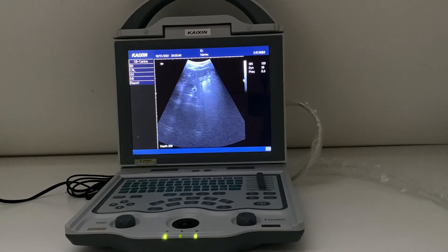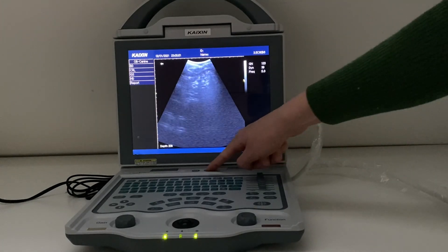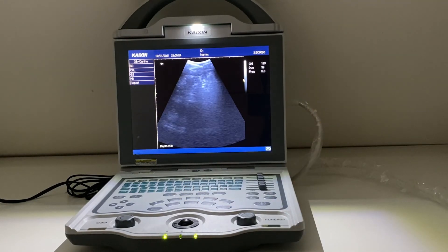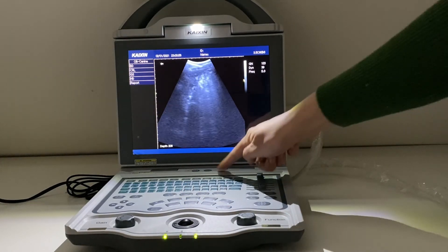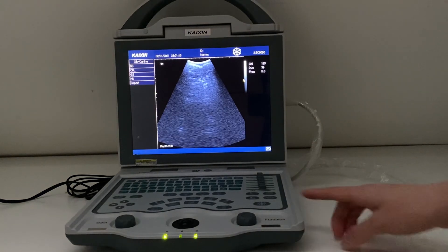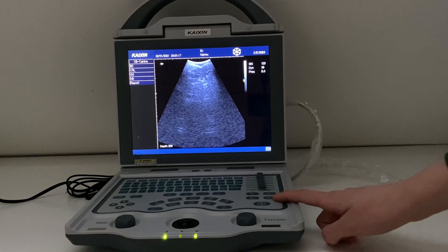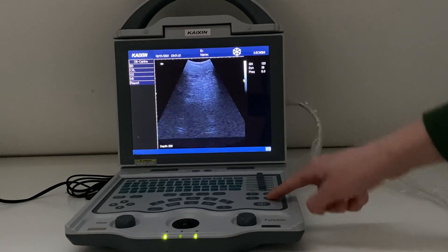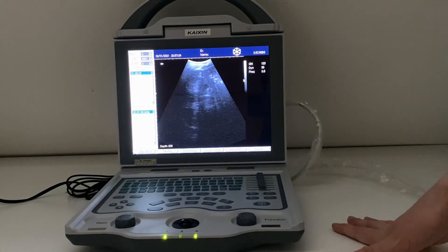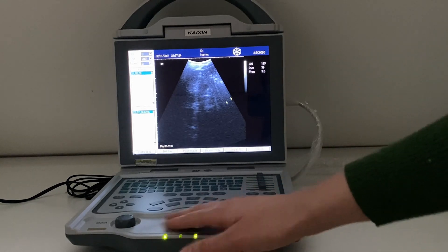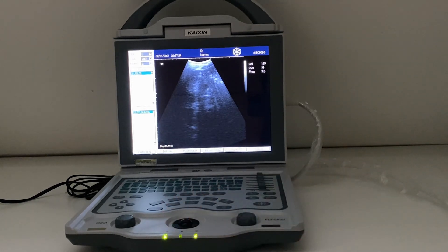If you're scanning in dark conditions, remember you've got a helpful button here that lights up your keypad. The review button allows you to go back and look over images you've already saved. From there, you can export them to USB by inserting a USB stick and selecting copy to USB.